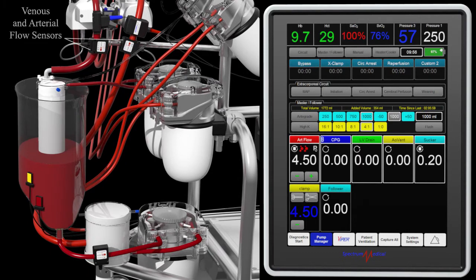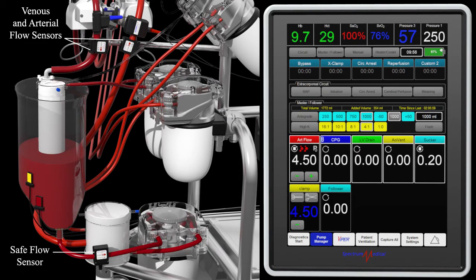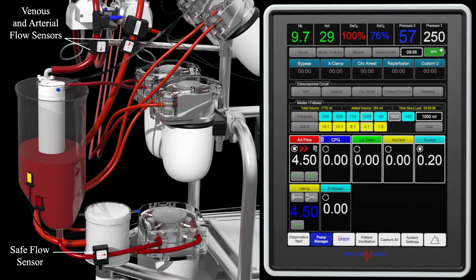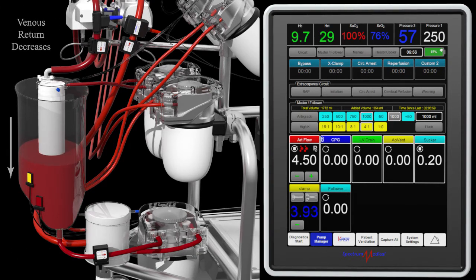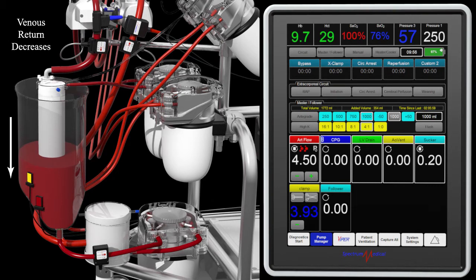However, to prevent the need for a pump stop, if the fluid level drops to the yellow safe flow level sensor, the Workstation slows the arterial flow to match the current venous return flow rate while remembering the original arterial pump target.